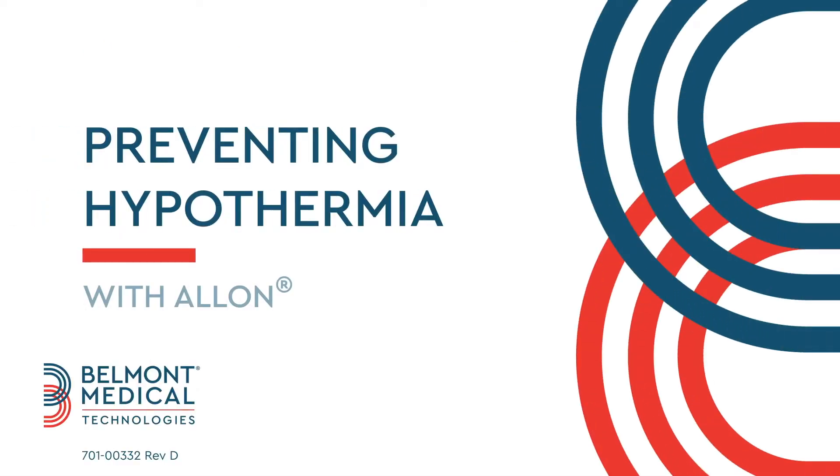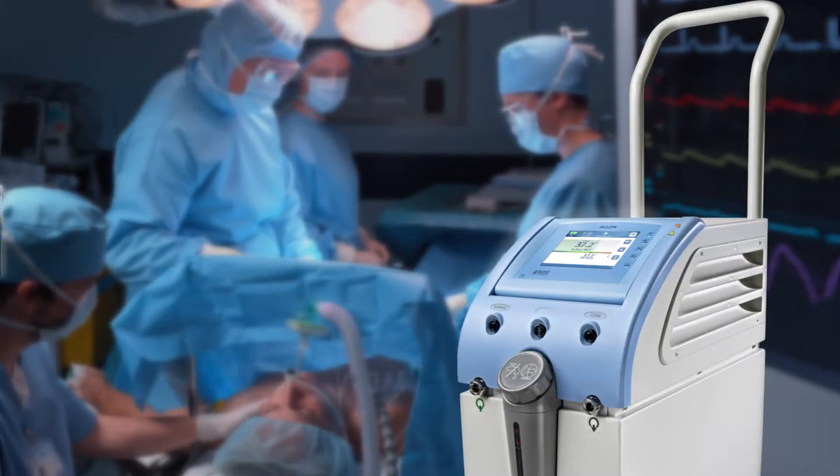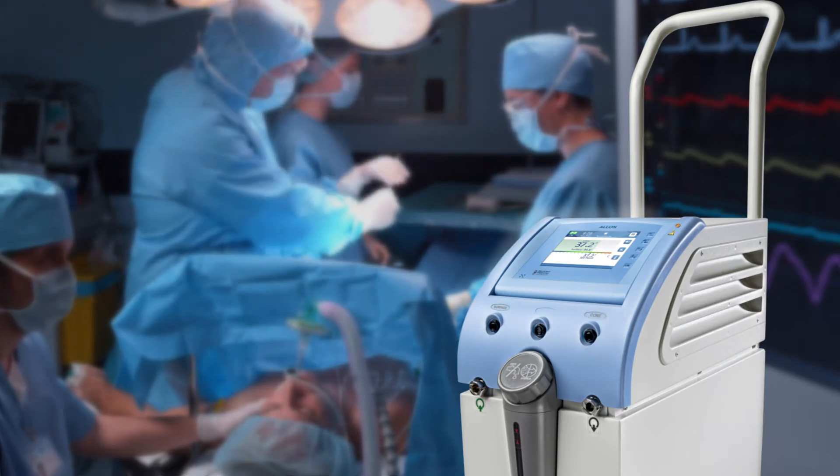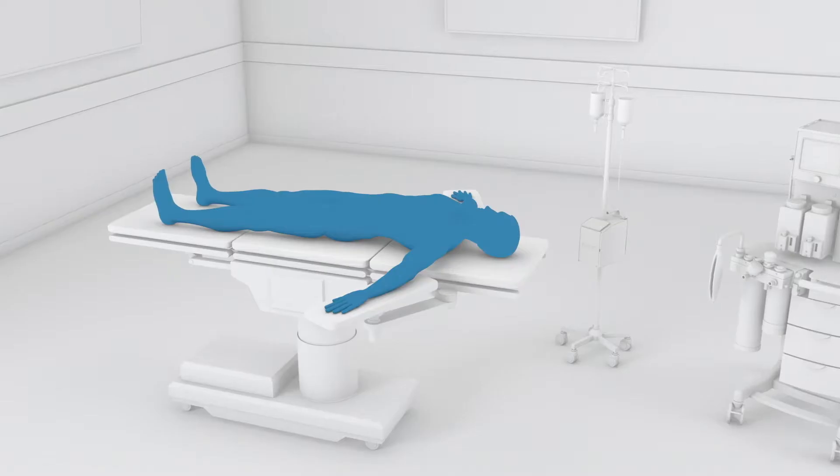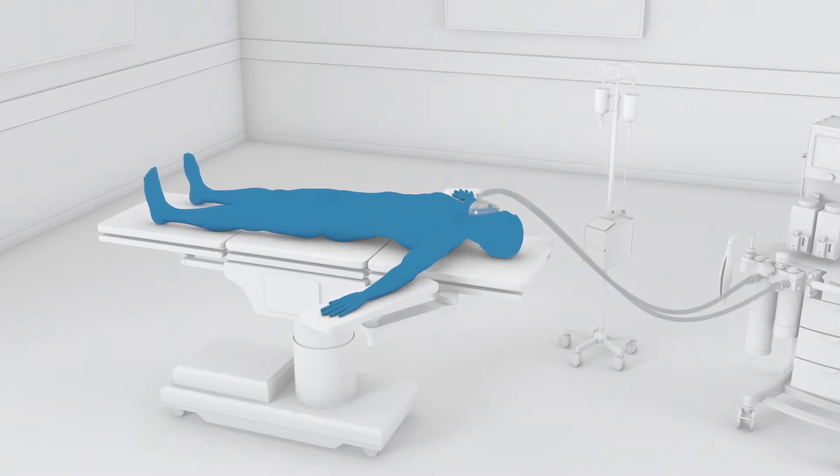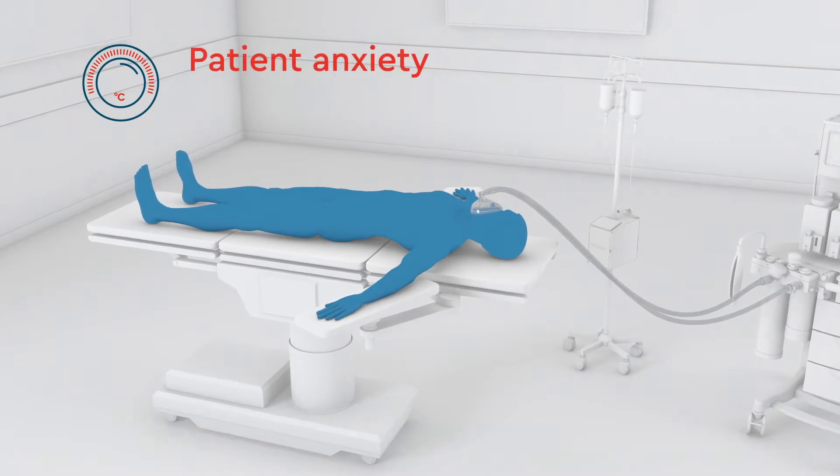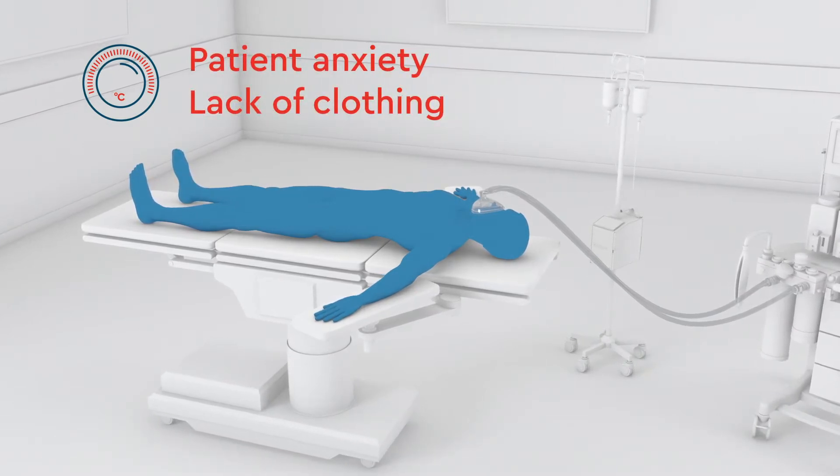Let's review why it's so important to prevent hypothermia during surgery and show you how Alon successfully maintains normal body temperatures during surgical procedures. Intraoperative hypothermia is common due to the body's response to anesthesia, as well as the operating room temperature, patient anxiety, and the lack of patient clothing.